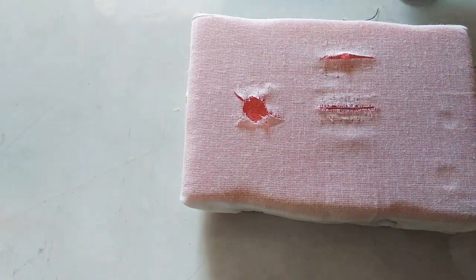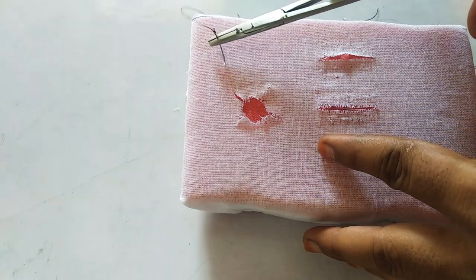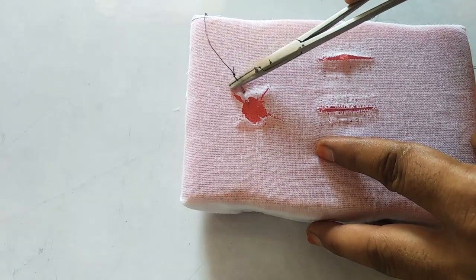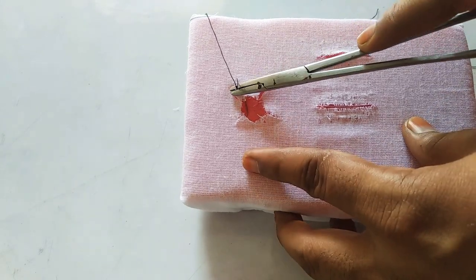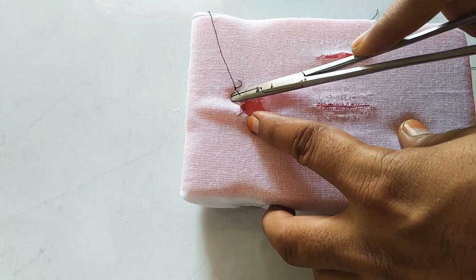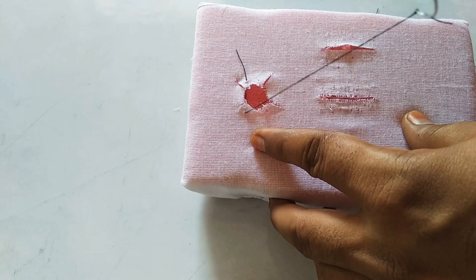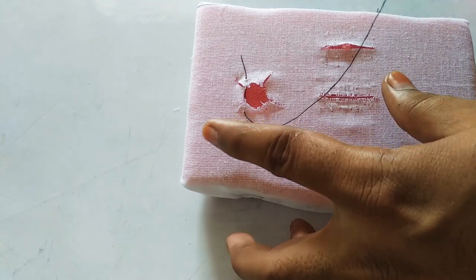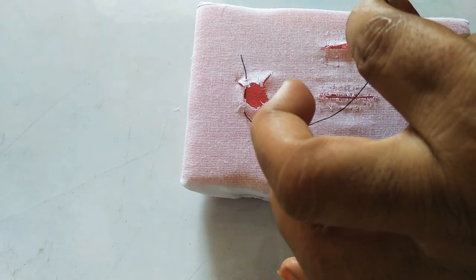First, you have to engage the buccal side mesial interdental papilla, like this. After that, you have to engage the mesial papilla on the lingual side, like this. So after engaging the lingual mesial interdental papilla, you come back onto the buccal side again.